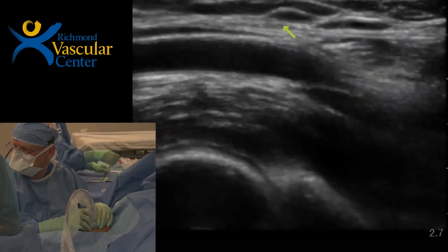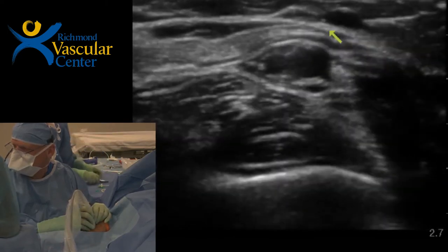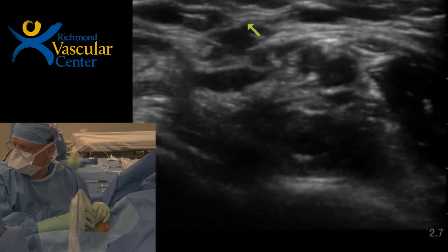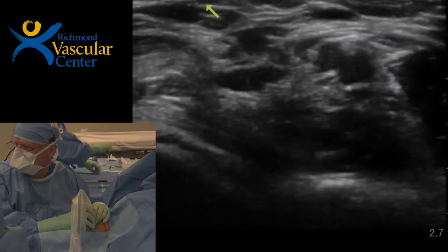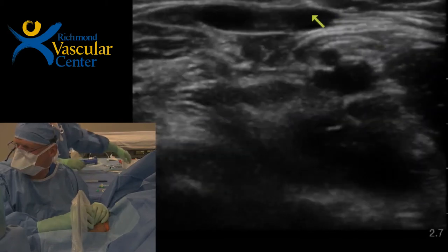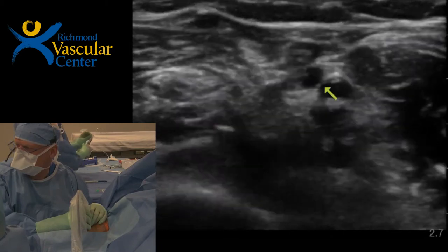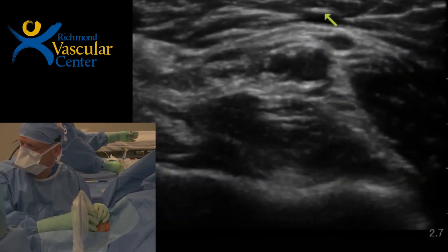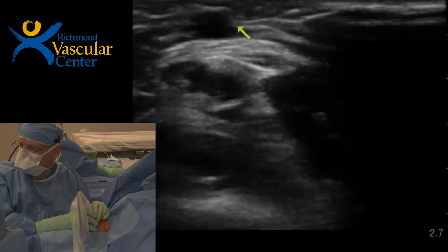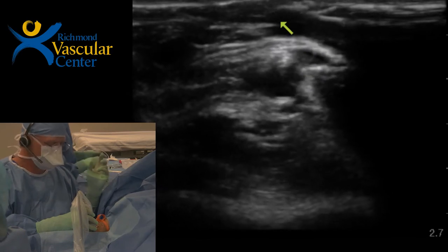But this right here, I think, is our cephalic vein. No, it's our basilic. Okay, so our cephalic comes way over here. So we're going to end up sticking the basilic vein and coming down through here and down like that, and then make our crossing right there. So it's good practice to spend a couple of minutes doing this, getting ready to access it. I like sticking the non-intended vessel. Yeah, marker. I'll do marker.